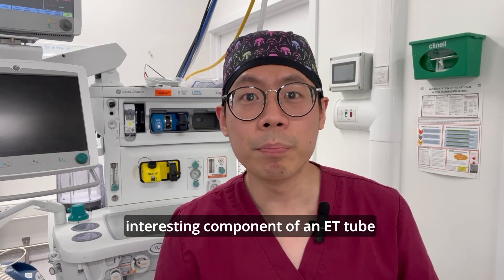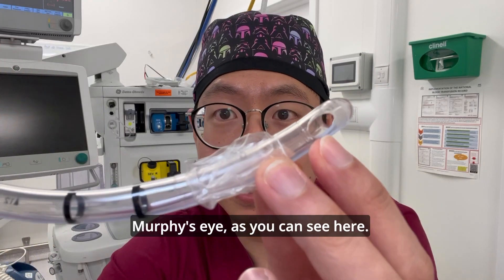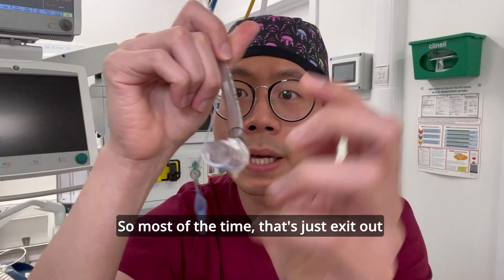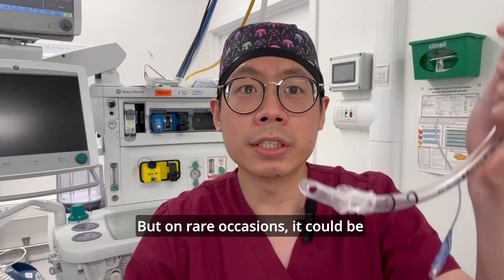The last interesting component of an ET tube is the presence of what we call a Murphy's eye, as you can see here. Most of the time gas will just exit out the bevel of the tube.